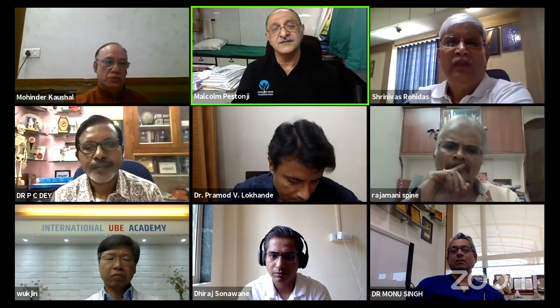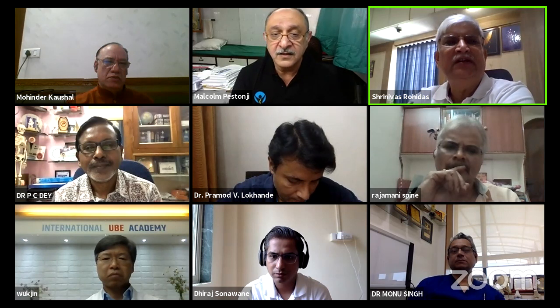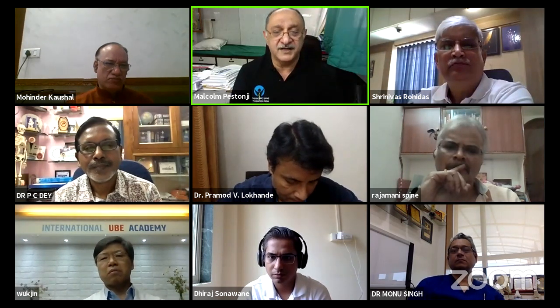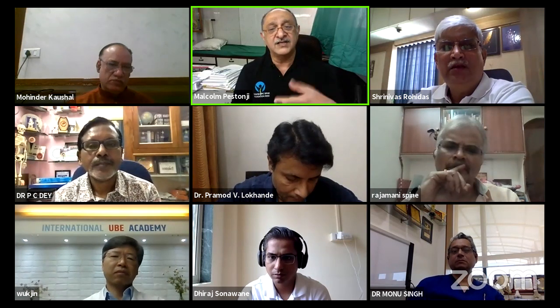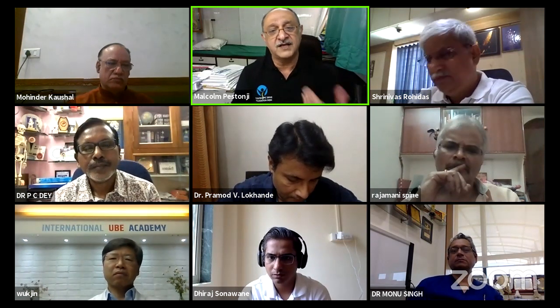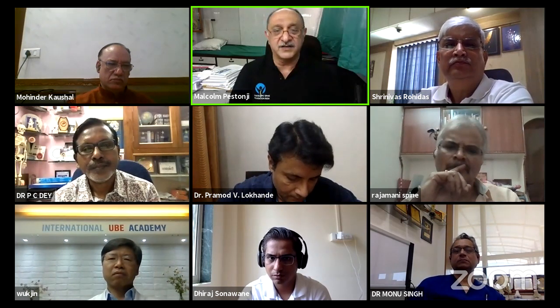Pramod Lokhande uses. How much is the diameter of the Lim scope? A Lim scope is around 9.8 or almost 10 millimeters wide, and a working channel is almost 6 millimeters, while Pramod uses an 8 millimeter scope with a working channel which is 5.5. So there are marginal differences over there, sir.